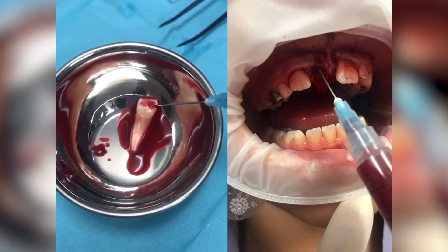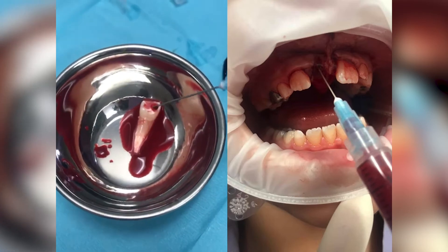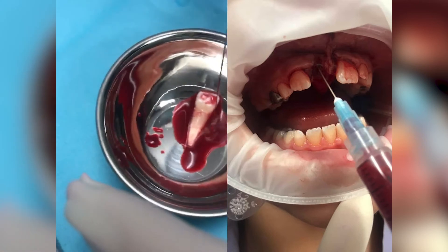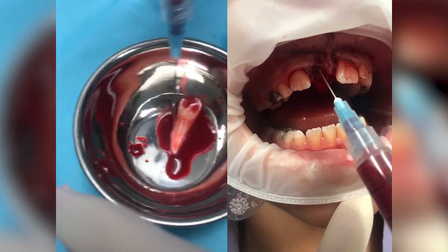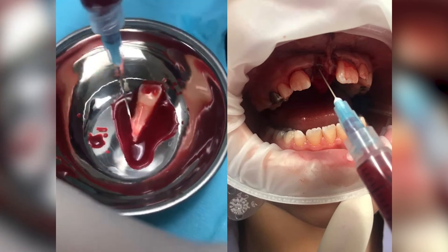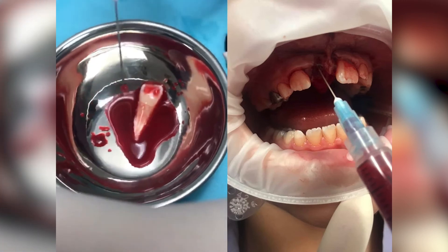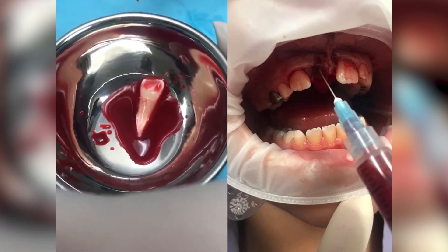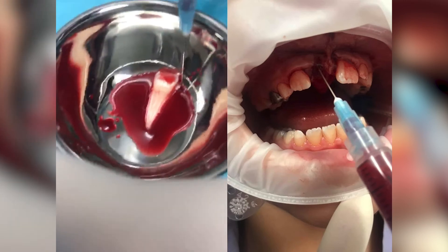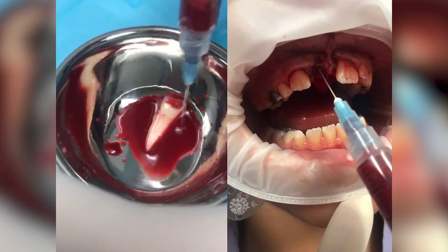The growth factors — we spin it and we are going to add it on the tooth without touching too much the root, because we still have some osteoprogenitor cells to work. Give me some because I have to add it into the tooth.